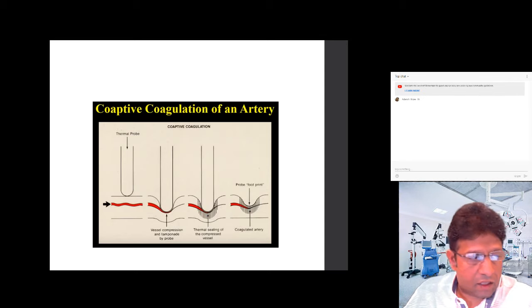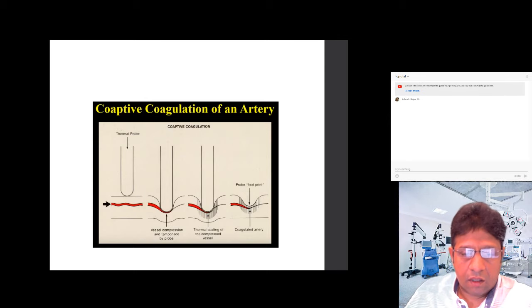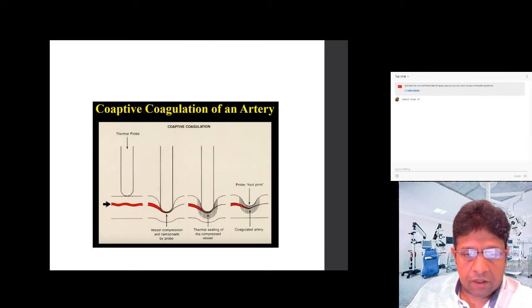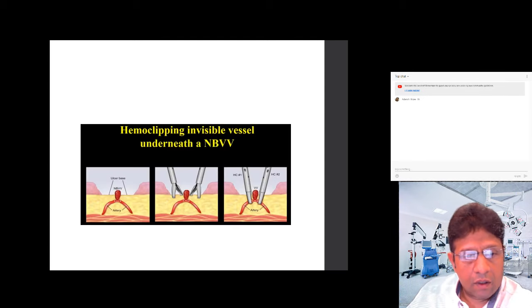With bleeding vessels, like the doctor said, it's a combination of sclerotherapy, heated probe therapy, clips. There's even an over the scope clip, OTSC, which we may not have a chance to look at today, but I'll definitely show it to you next week. And you also have the banding, which is not used for ulcers, but it's used for bleeding varices.